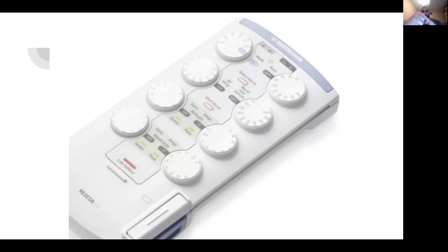If there's gunk building up around the electrode, then it's moving the electrode away from the heart a little bit, fractions of millimeters. But those fractions of millimeters can add up and make a difference. So then you need to increase the energy to make sure that you still stimulate the heart. That's a long-winded way of saying if the threshold is 3, set the voltage to 5 or 6. That's the point there. Same applies for the atria.